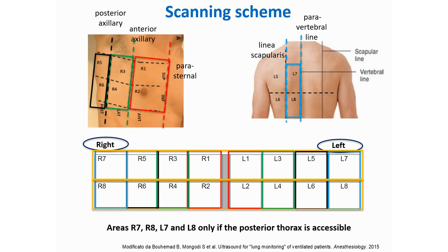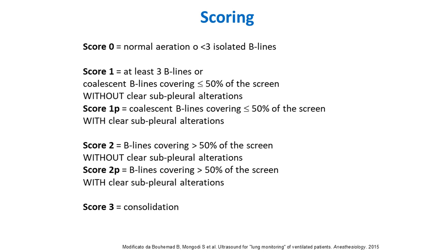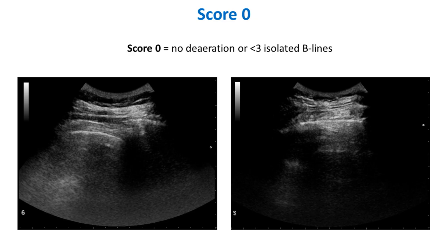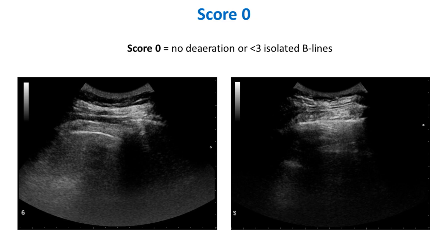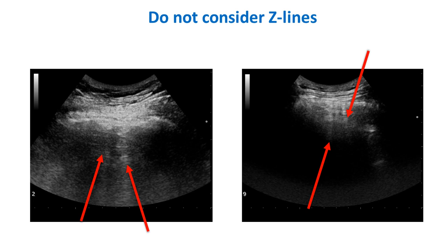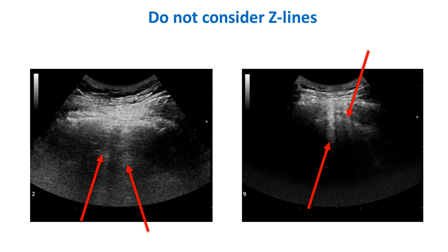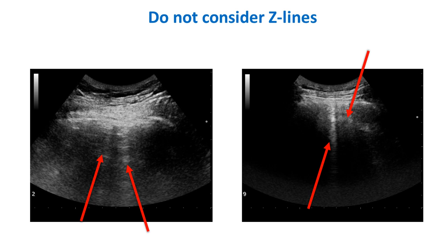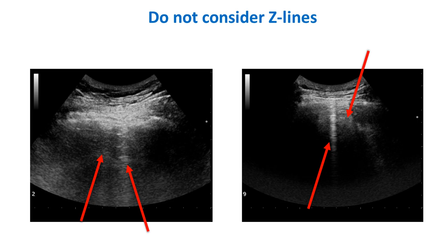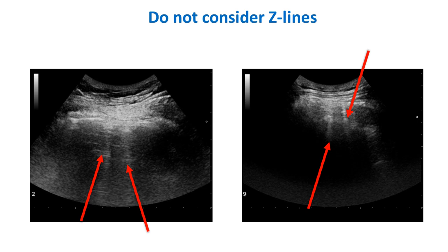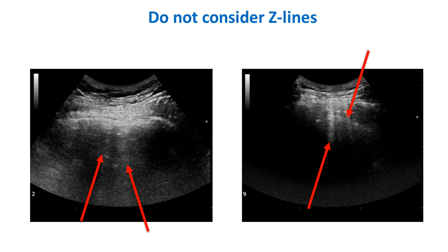Using a standardized scanning scheme is also useful because it allows some kind of scoring. We use a previously validated score, assigning a score of 0 when we have no B lines or fewer than 3 B lines. We have to be careful not to mistake Z lines for B lines. Z lines are also hyperechoic vertical artefacts but without any specific pathological meaning. Compared to B lines, Z lines are less defined, more blurred, do not clearly move with respiration, and do not clearly start from the pleural line.